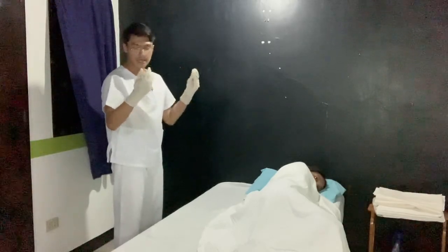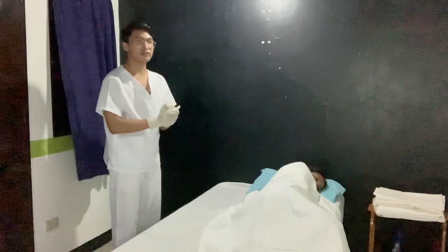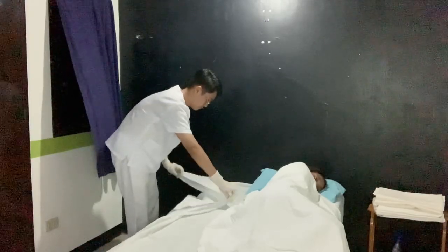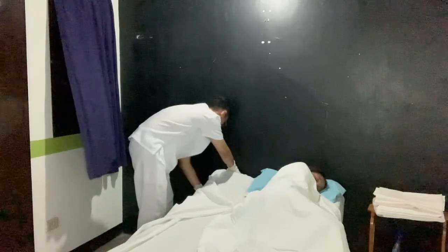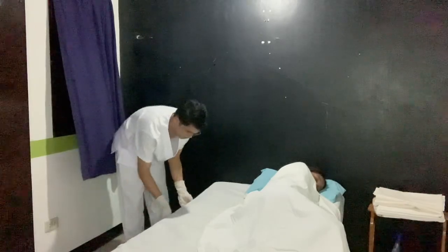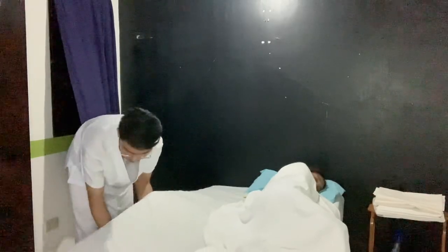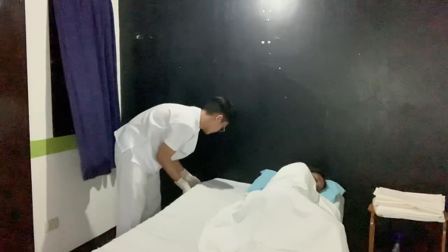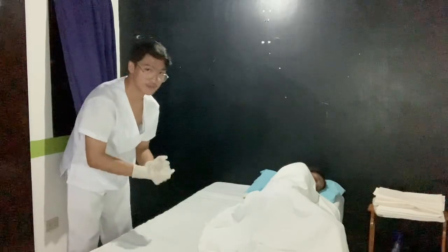Now, in tucking the bottom linen under the mattress, you need to miter the corner. Make sure it is wrinkle-free.